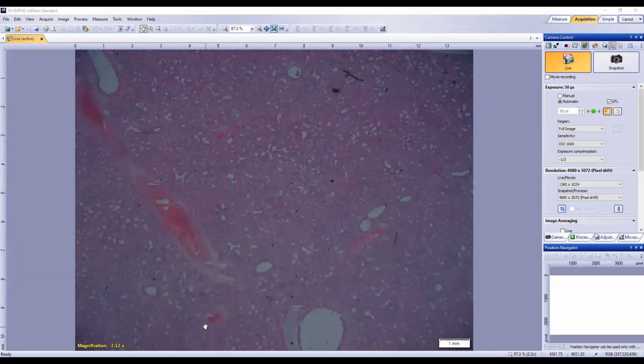In certain organs you can do an outside-in approach or an inside-out, and you might change that depending on what process is going on in front of you, or what the most likely pathologic process is. In this case, let's start from inside out and list our compartments from the innermost part of the parenchyma out through to the edge of the lung.